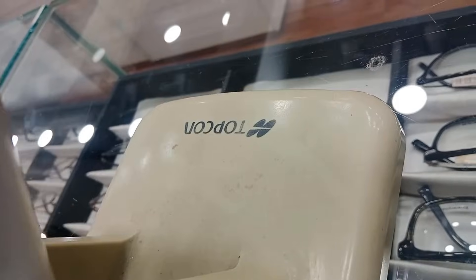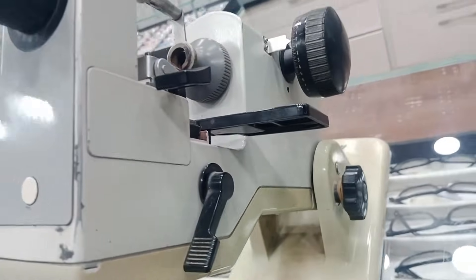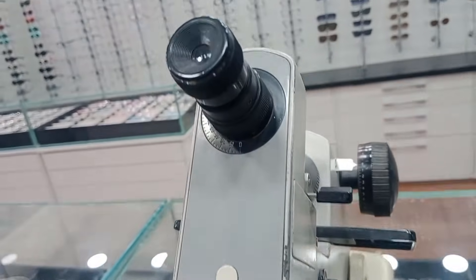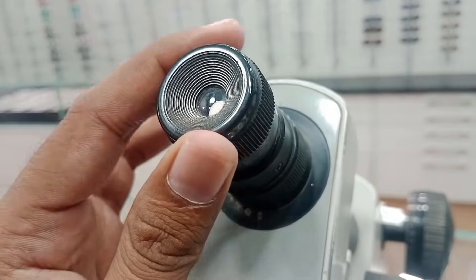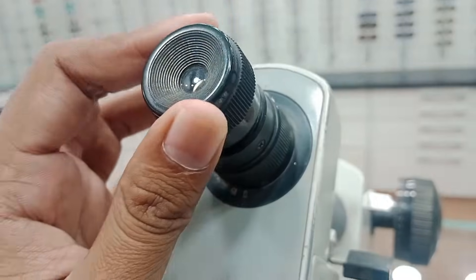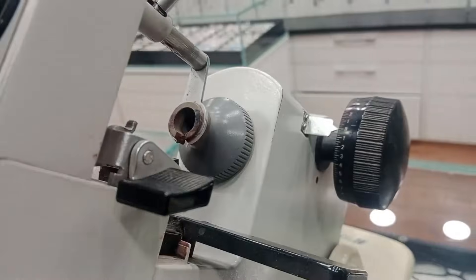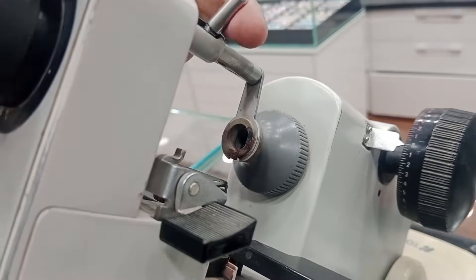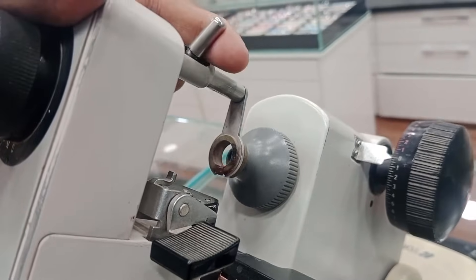So this is an antique type of top-on manual lensometer. We will discuss different parts. First of all, this is the eyepiece and this one is the lens holder to hold the blank on the spectacles.